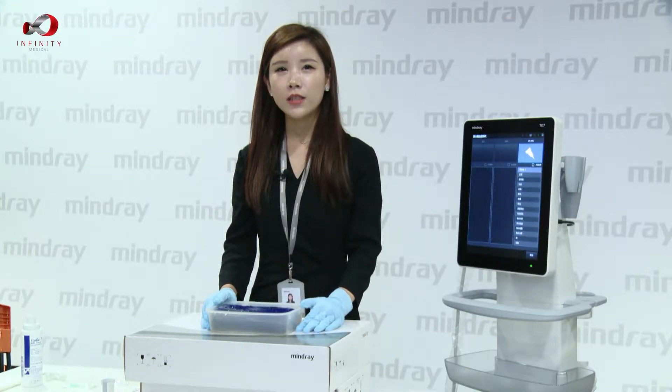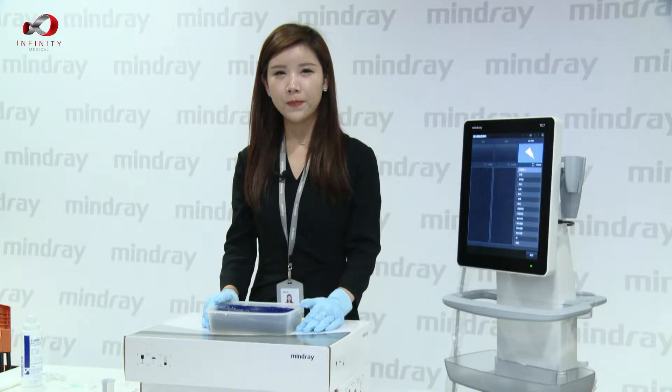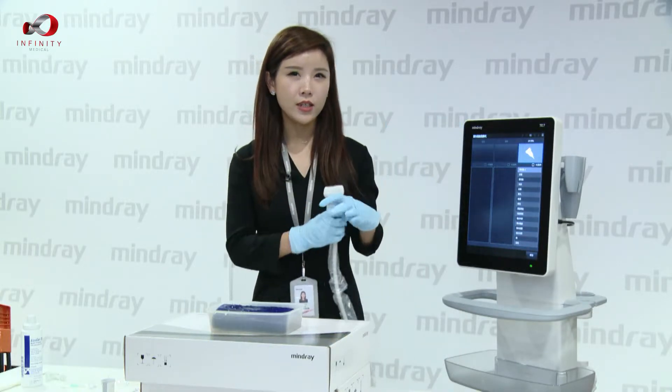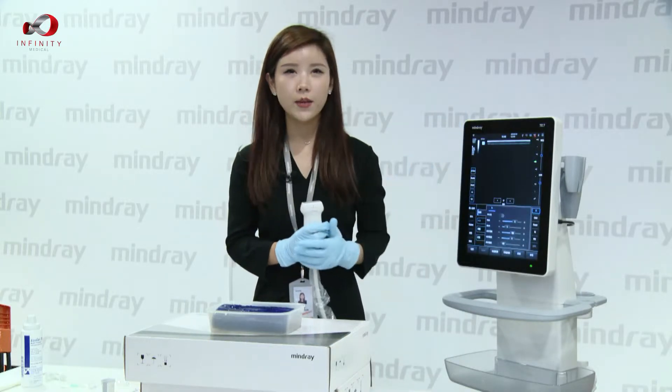Then we can start our demonstration procedure. Firstly, we need to choose the right probe for performing this function. So let's choose the right probe.